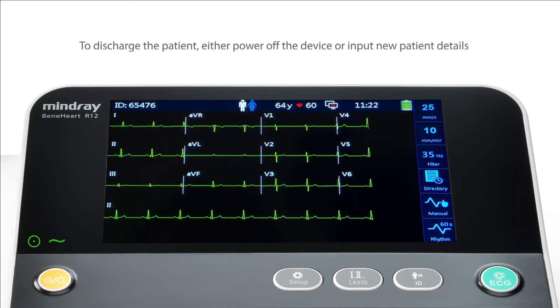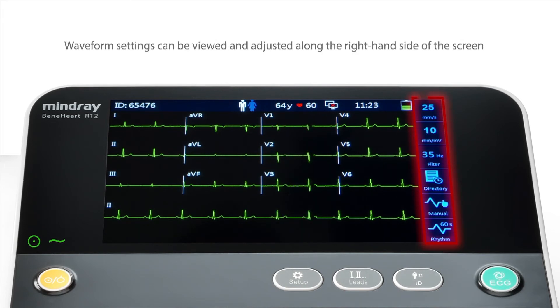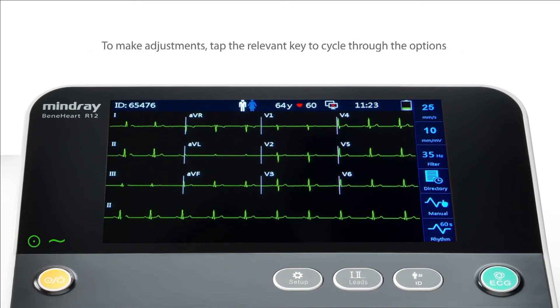To discharge the patient, either power off the device or input new patient details. Waveform settings can be viewed and adjusted along the right-hand side of the screen. To make adjustments, simply tap the relevant key to cycle through the options.